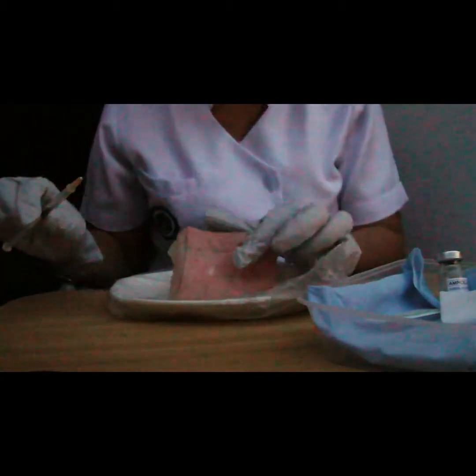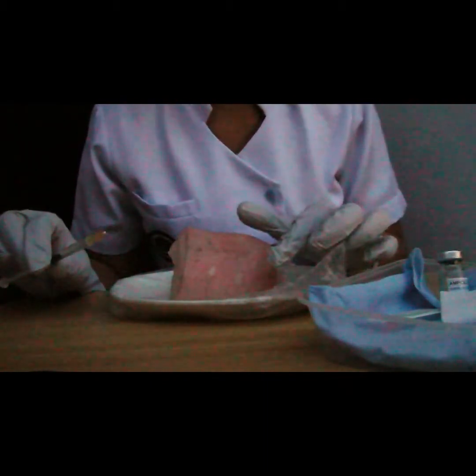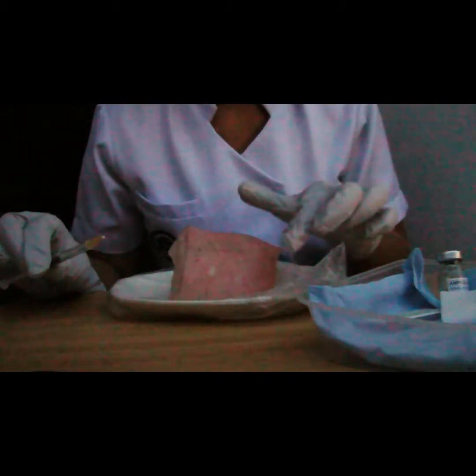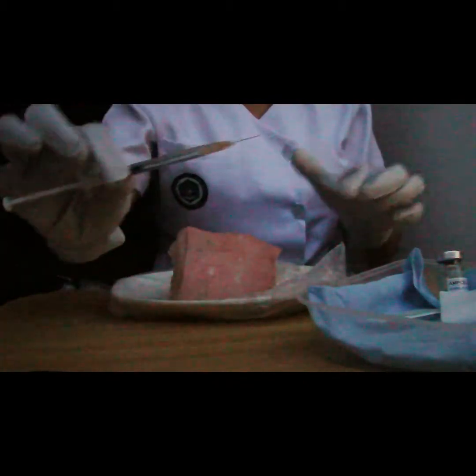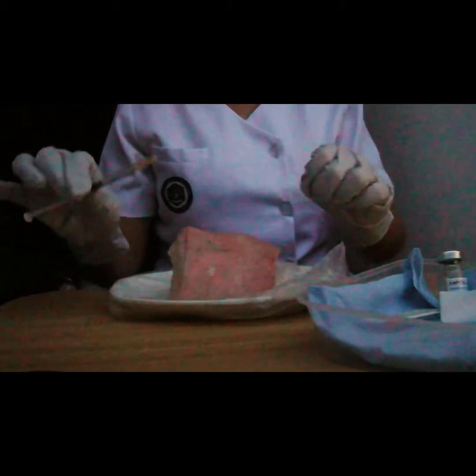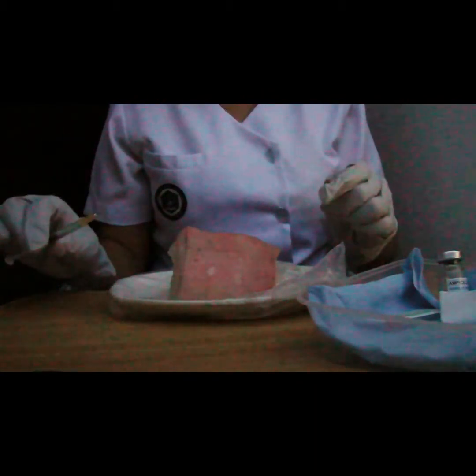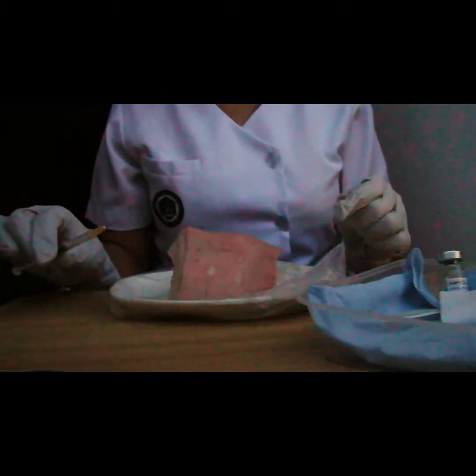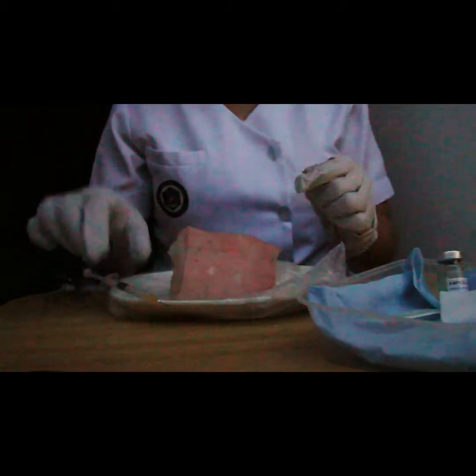Do not massage the area because massage can disperse the medication into the tissue or out through the needle insertion. Dispose the syringe and needle safely. Do not recap the needle in order to prevent needle stick injuries. And remove the gloves.